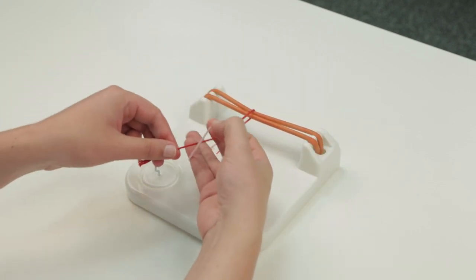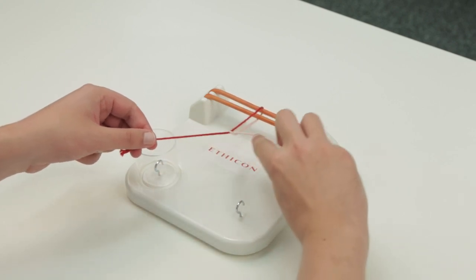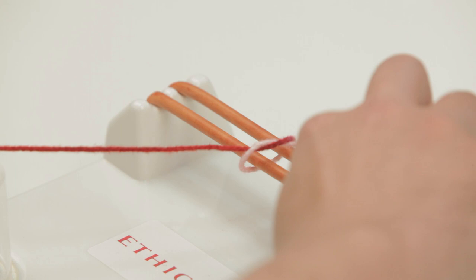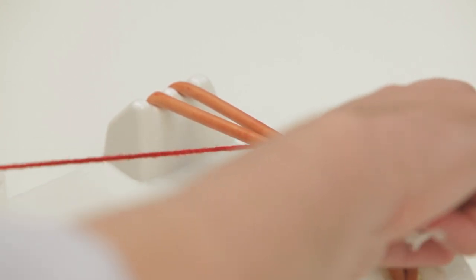Roll your digits so that the string lies on the back of the ulnar aspects of your digits and use your middle finger to turn and loop the suture through. Push it away from you ensuring there is a square knot.